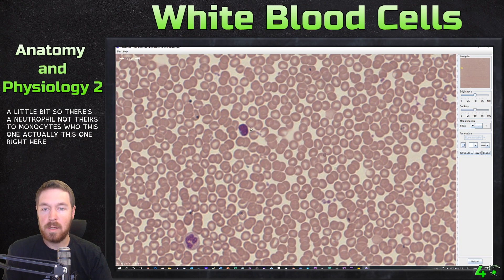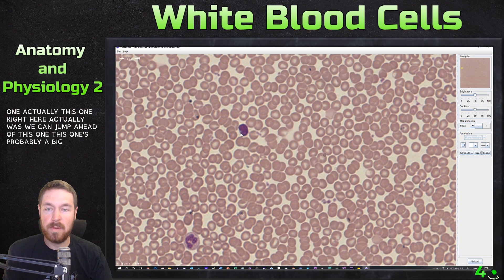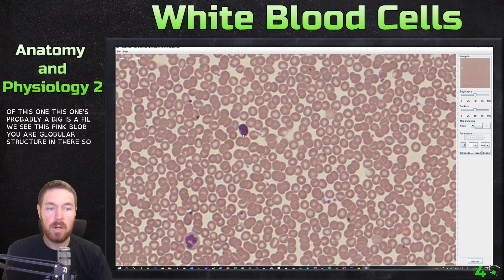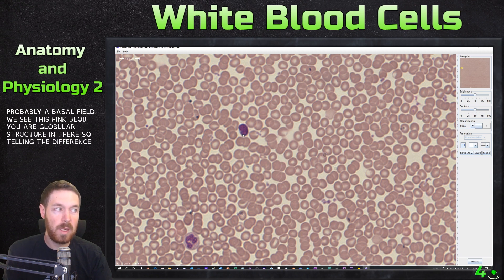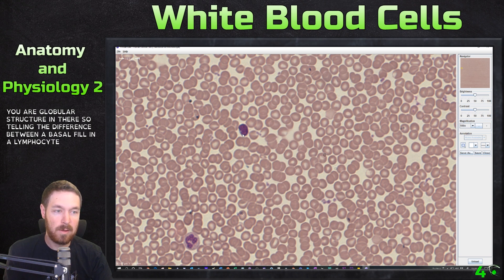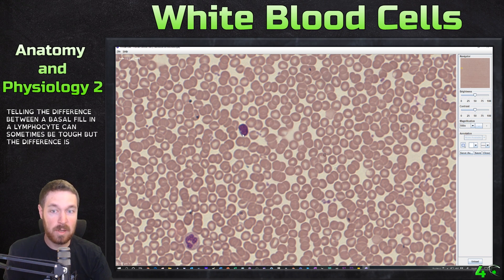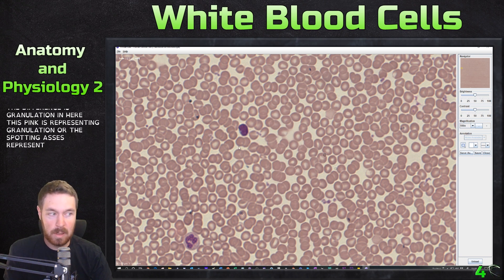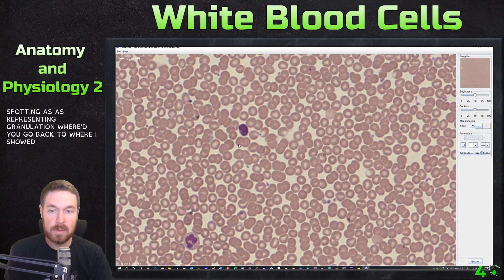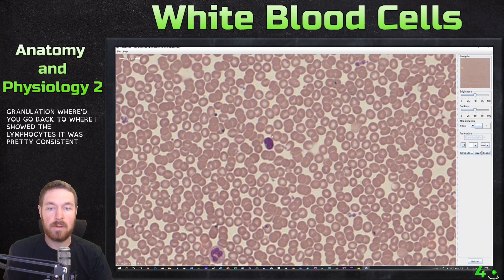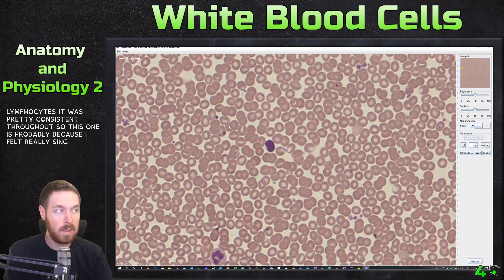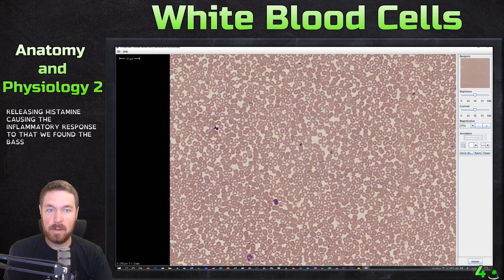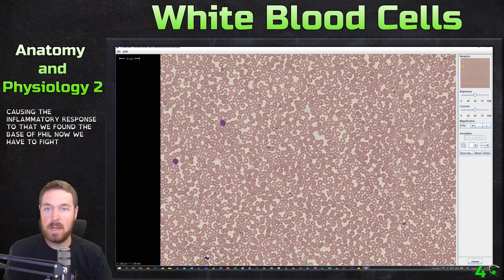This one right here is probably a basophil — we see this pink globular structure in there. Telling the difference between a basophil and a lymphocyte can be tough, but the difference is granulation. The spottiness here represents granulation, whereas the lymphocyte we saw earlier had a pretty consistent interior. So this is probably a basophil, which releases histamine and causes the inflammatory response.